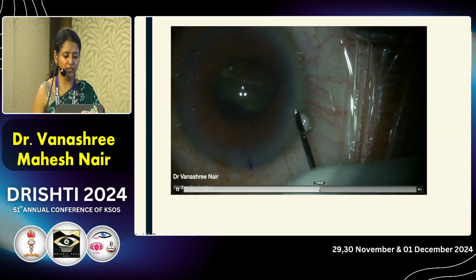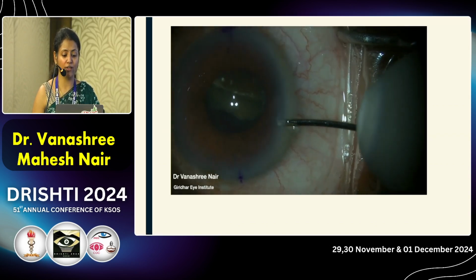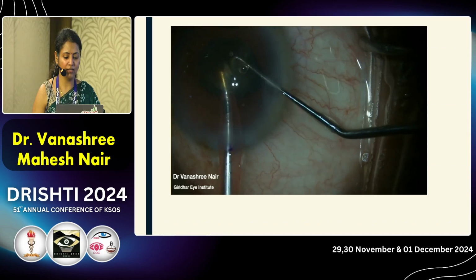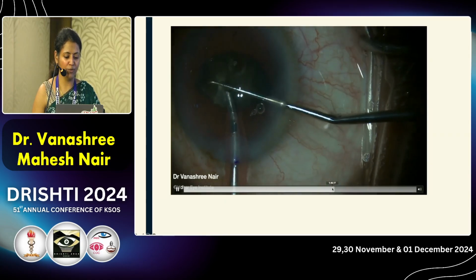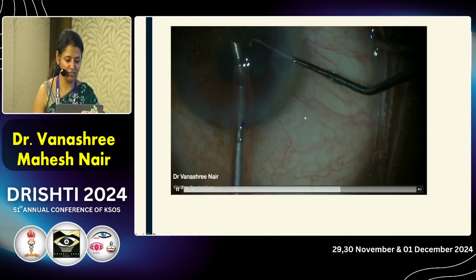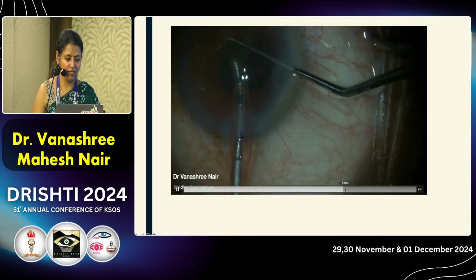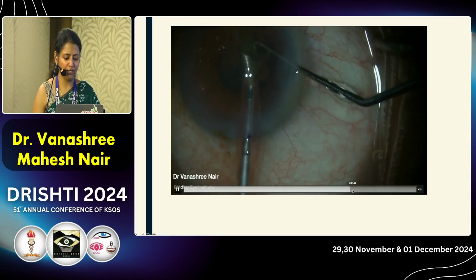As I proceed ahead, I thought of hydrating the side port. This is another trick that you can use if your iris is popping out. What this does is it seals the wound a little bit and makes life a little more comfortable. But as I'm proceeding ahead, the iris decides, no, I'm going to be a little more mischievous, and it starts slightly popping up, but I'm much more comfortable here and can proceed safely.